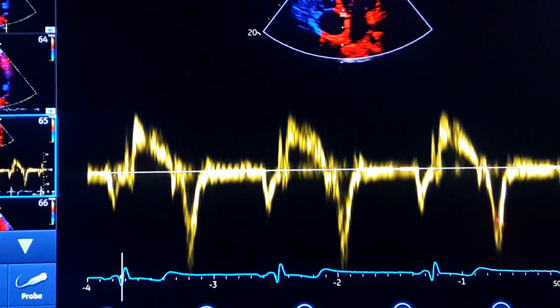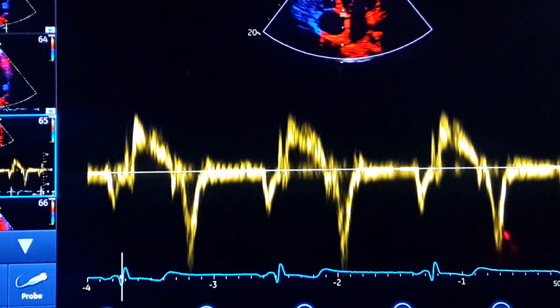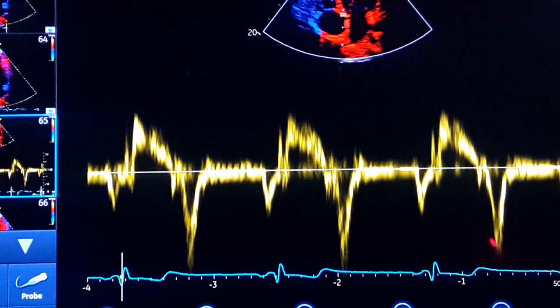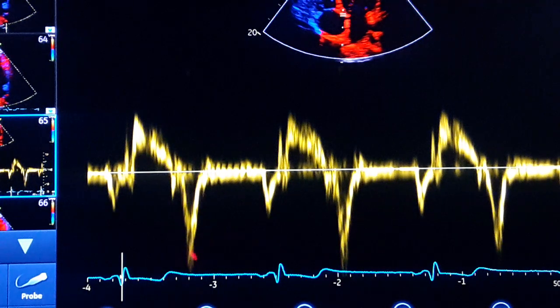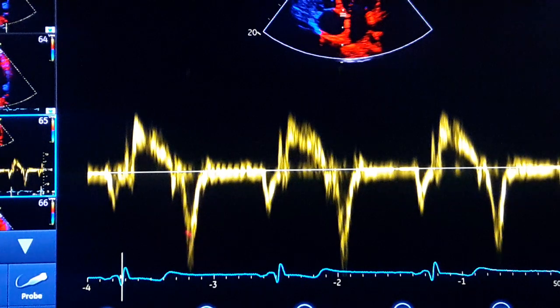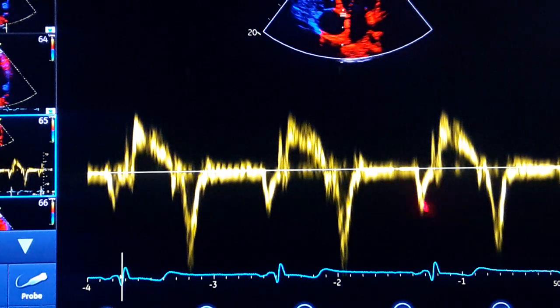This one is E' and A'. One of the most important rules when measuring E' and A' is that you should not overestimate. The rule is: where these two sidebands cross each other, that spot is your measurement. Don't go beyond that. You should not include spots past where the strongest envelope trimmings cross each other. So this spot, this spot, and this spot are the right measurements for E', and A' is the same — you don't go too far, just to the place where they cross each other.